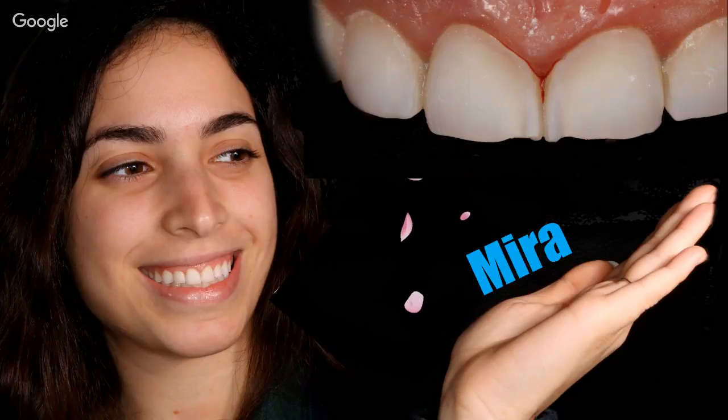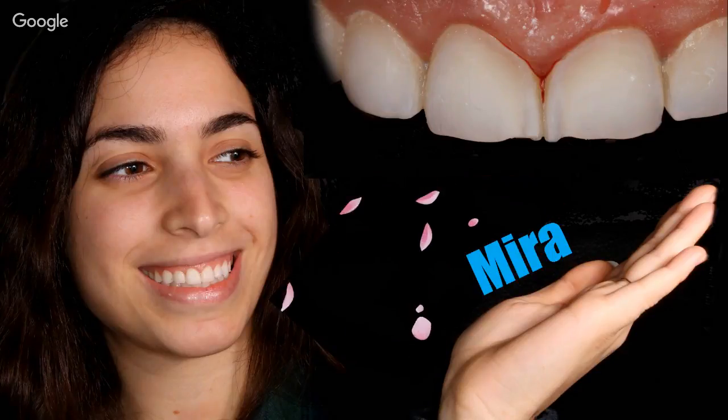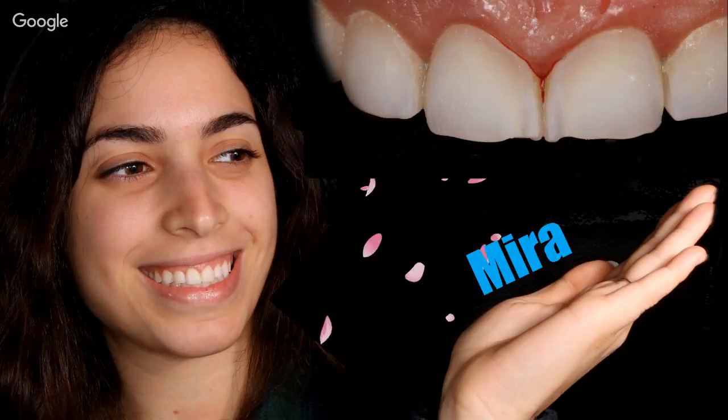But Mira wants to see the final result before she even starts. She wants to bleach the rest of her teeth, and she wants to see, with 2 restorations on her centrals, how she's going to look. The picture you see on top is simply just after Profi-Jet and sandblasting, and this was not prepped.